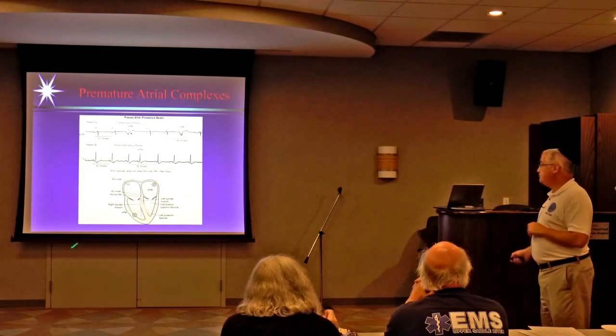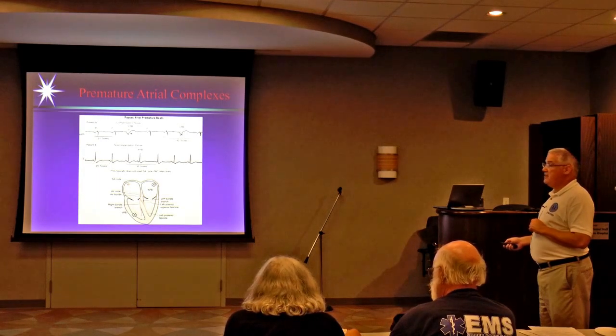You're going to put them on the monitor. You're going to see they're in a sinus rhythm, and you're going to see they have an earlier beat than normal.